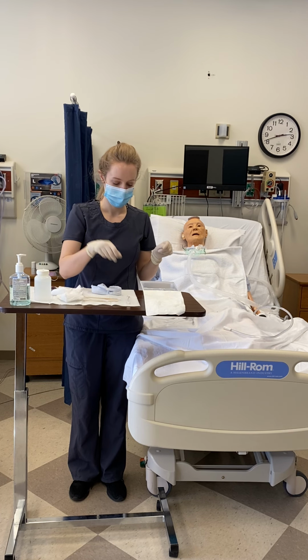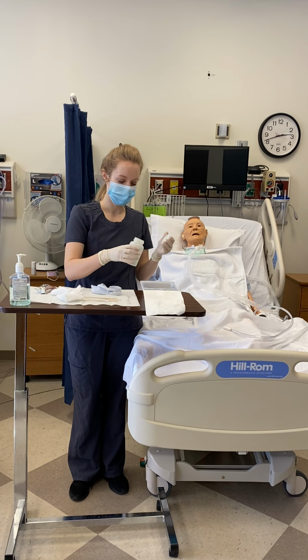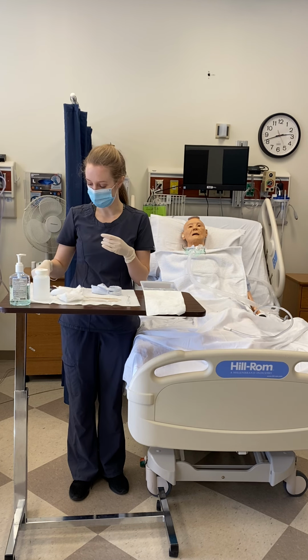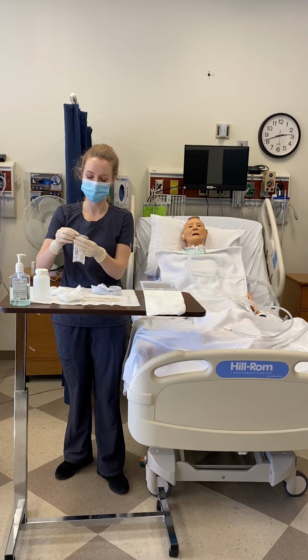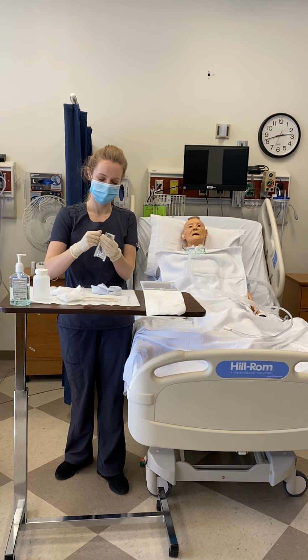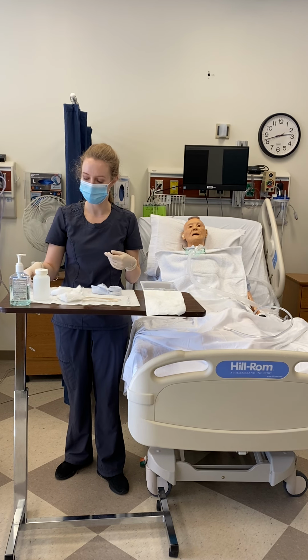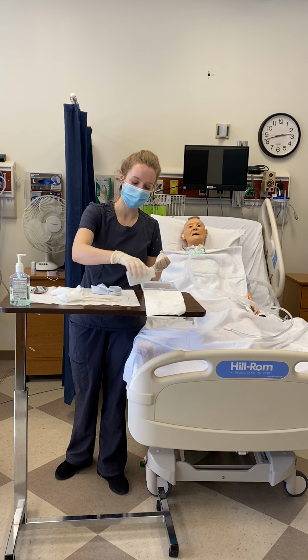So first thing that I'm going to do is I'm going to put saline in 2 compartments, and in one of them I'm also going to put some hydrogen peroxide, half and half, and then I'll save some hydrogen peroxide if I need that for later. But in the third one, for my cleaning step that's last, I also want just plain saline.